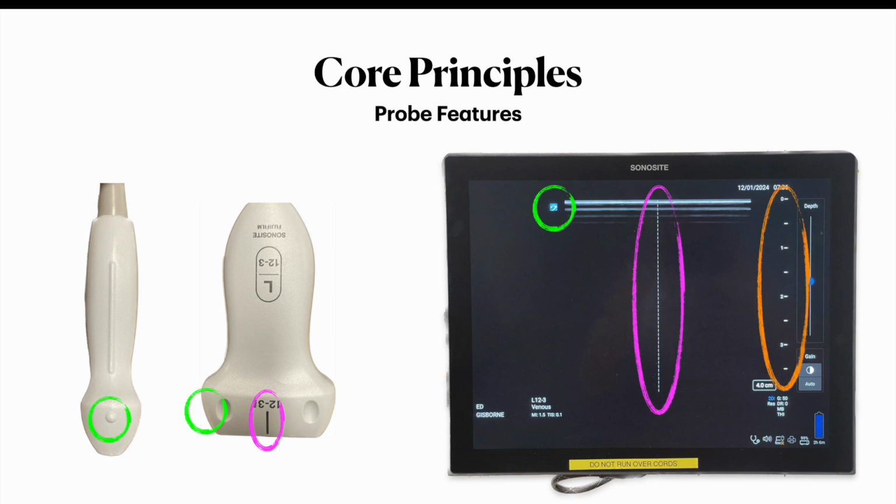And finally, the last feature I want you to be aware of is the depth measurement on the side. You can see it runs from 0 to 4, and this is in centimeters. So if we get to 1, this means that you're 1 centimeter below the skin surface. Now note, you can change the depth, but to me this is an advanced technique that you do not need to use to perform peripheral guided IV insertion.